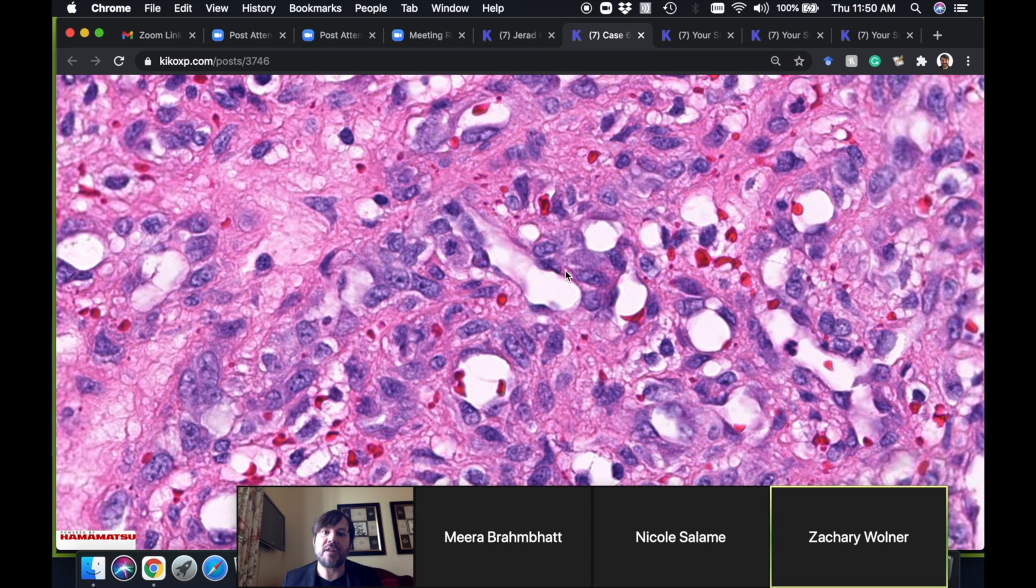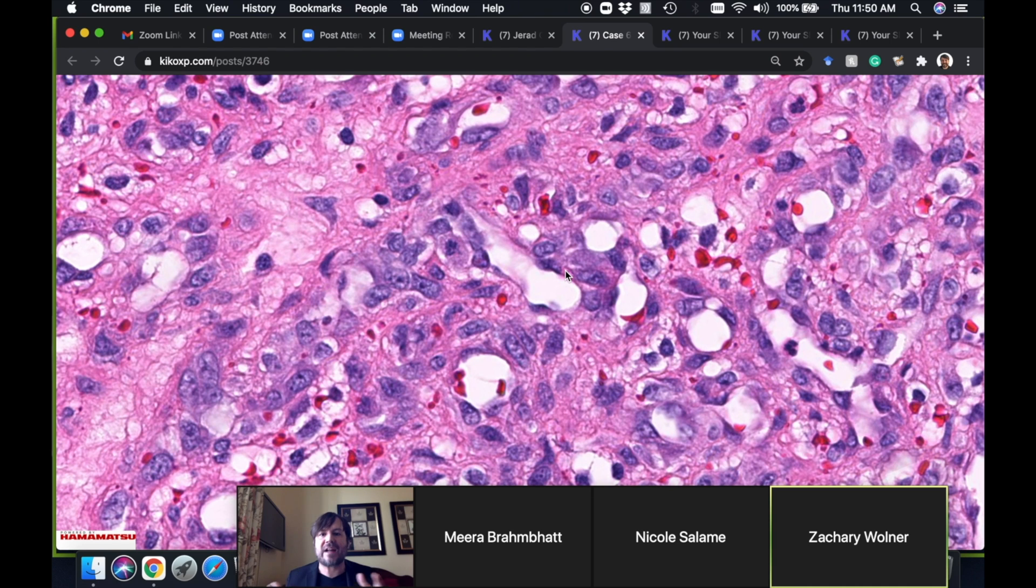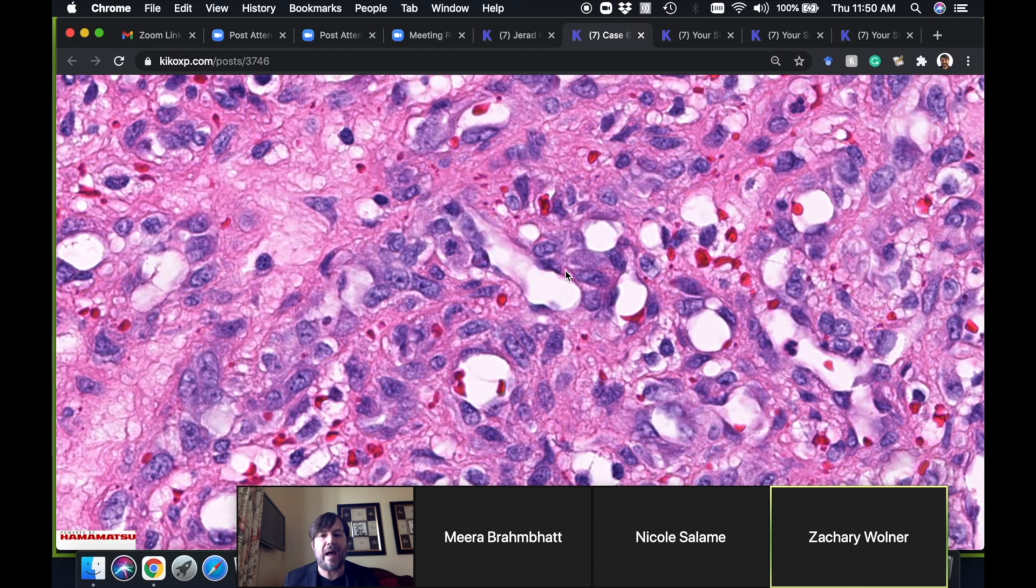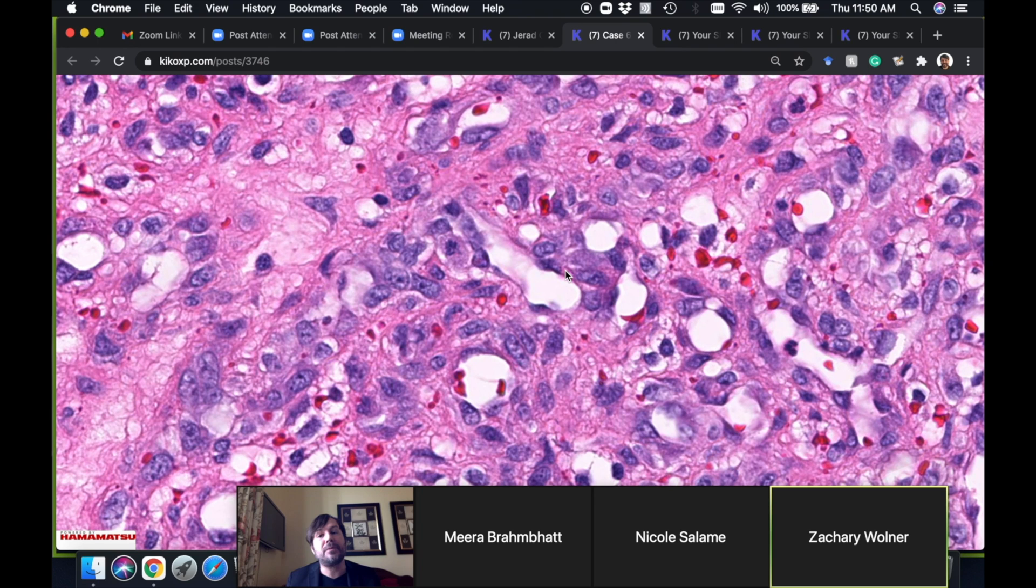The endothelial cells can get pretty plump—I mean look at those guys, they're big and juicy, they're plump, they have large nuclei. They look different than regular endothelial cells because they're actively growing and probably have some reactive changes related to the background inflammatory environment. You can see mitosis, so large cells and mitotic activity is to me a normal feature of pyogenic granulomas.